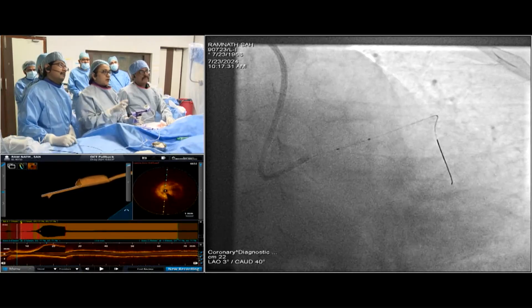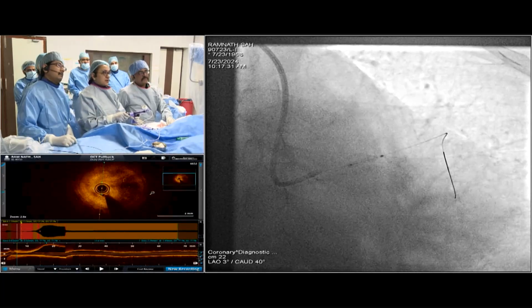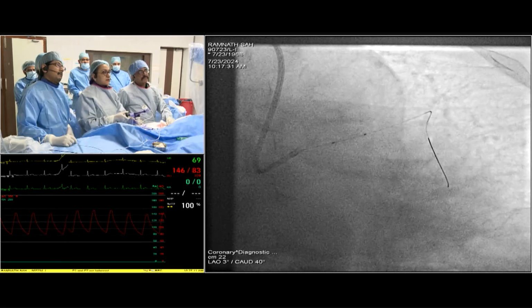At 2.5 they have 3 blades. If you go to 3.5, they have 4 blades across it. So in this way it gives you a more predictable position. Yes, sir.